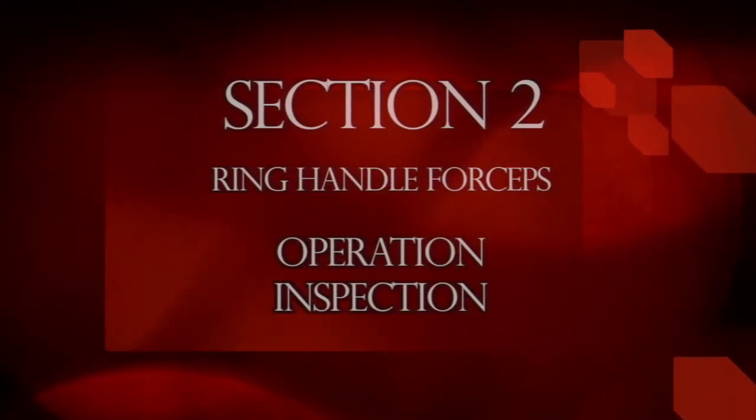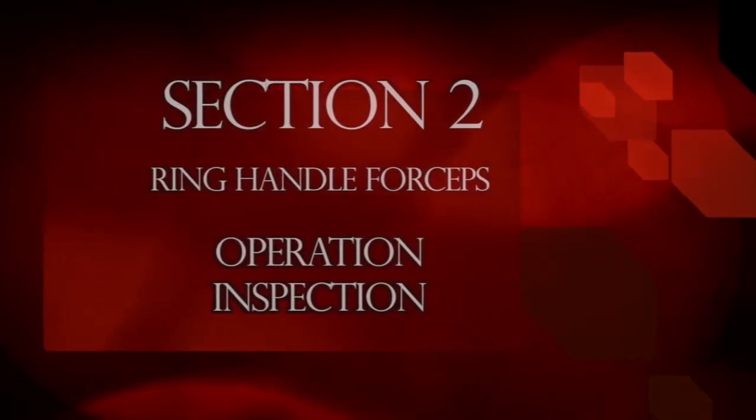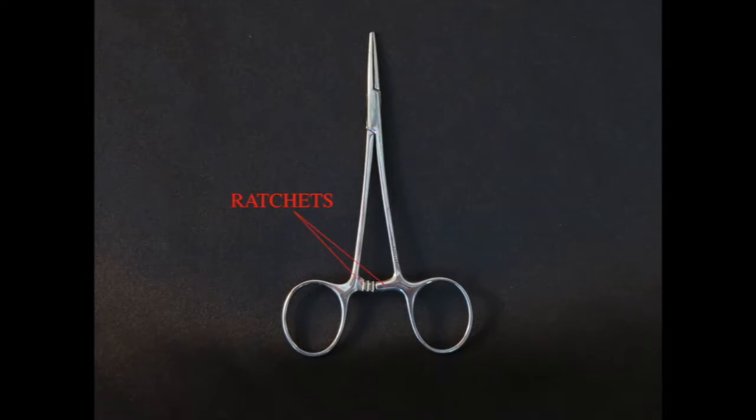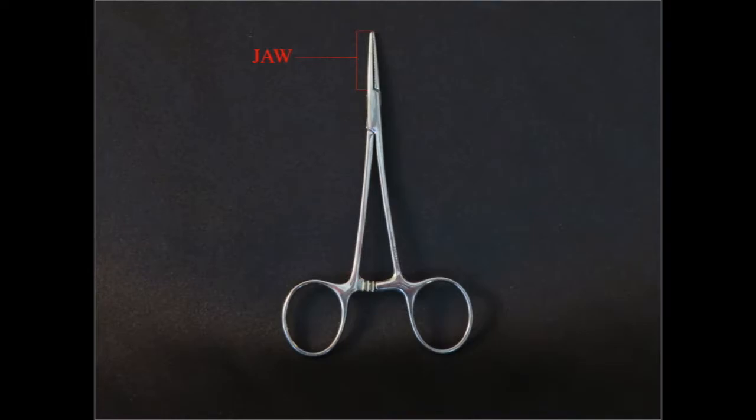This section will explain how ring-handled forceps operate and how to inspect them. The vast majority of ring forceps operate with the same basic settings that balance three different adjustments. The box lock, ratchets, and jaws must be adjusted in a balanced relation to each other for the instrument to operate correctly.